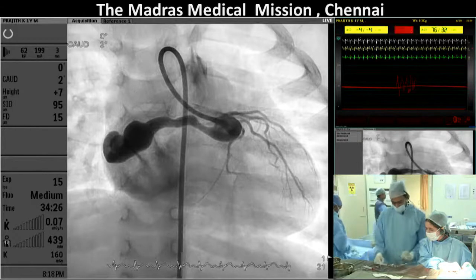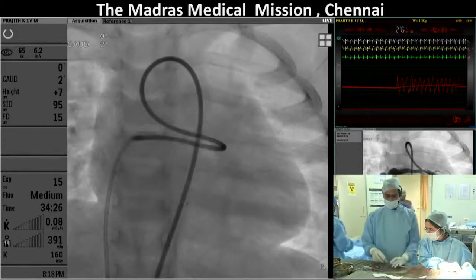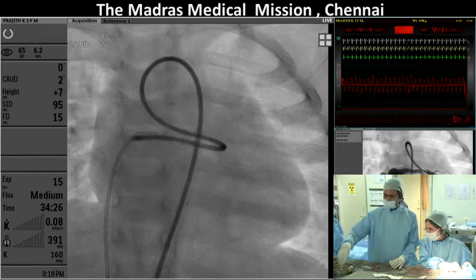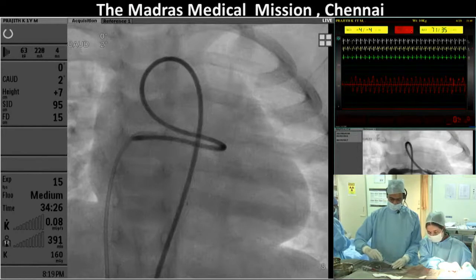I'm going to pretend to be a surgeon, and if I was a surgeon, I'd be closing this at the right atrial end, and I wouldn't mess around elsewhere, so it would be less precise than you might imagine a surgeon would do. Yeah, pass the microphone back.